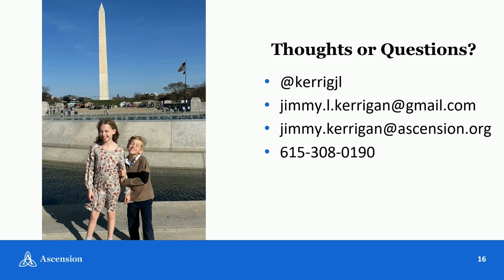Yeah, these are very sophisticated questions that require a lot more time than we have, but I'll say the advantage of a coronary CTA is going to be highest in patients that have a large burden of non-calcified plaque, which is why I showed that case of a young person with extensive non-calcified plaque, especially for the age of 32. The other advantage is following response to therapy. We cannot use calcium to follow response to therapy.